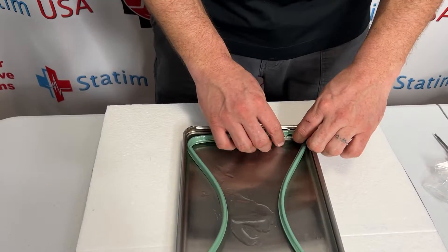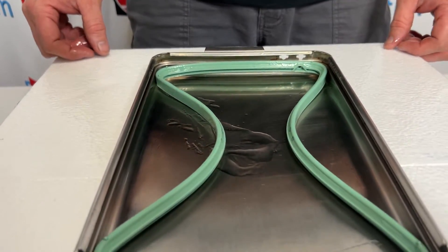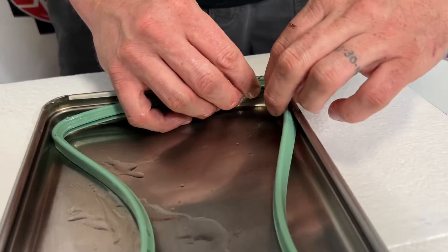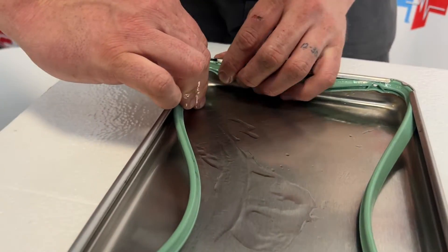The holes should be in the back of the cassette. We're just going to loosely set this in there like that. I'm going to start in this corner, lining up each nub and pressing it into place, and we're going to do all four corners that exact same way.